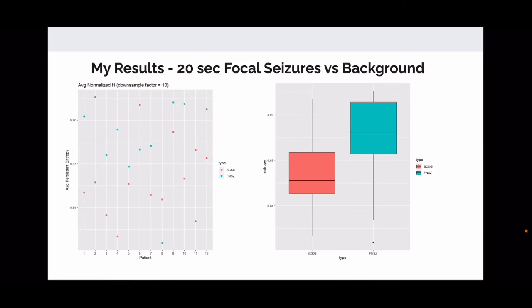Okay, and we got the results, pretty much unremarkable, not really a correlation, and you think that's due to what reasons? Maybe that 20 seconds is just too short. Yeah. Too much random stuff going on. Yeah, you might need a longer data size, I guess. I guess that's why it's recommended to have the EEG at least 20 minutes. That's like the national recommendations or whatever. At least 20 minutes of uninterrupted EEG.